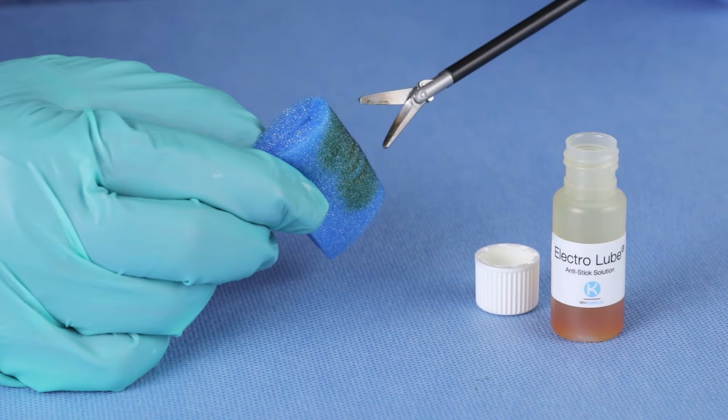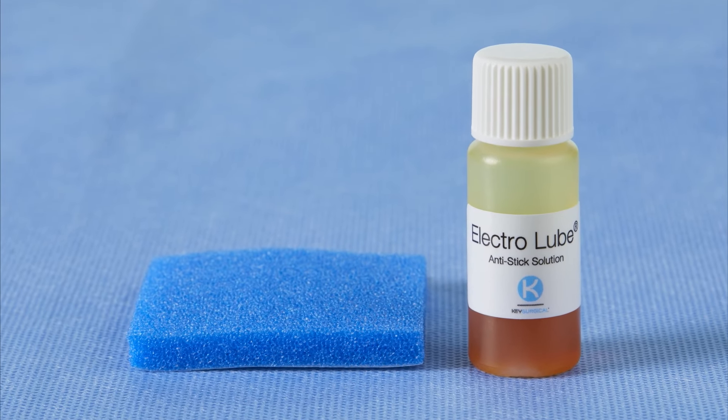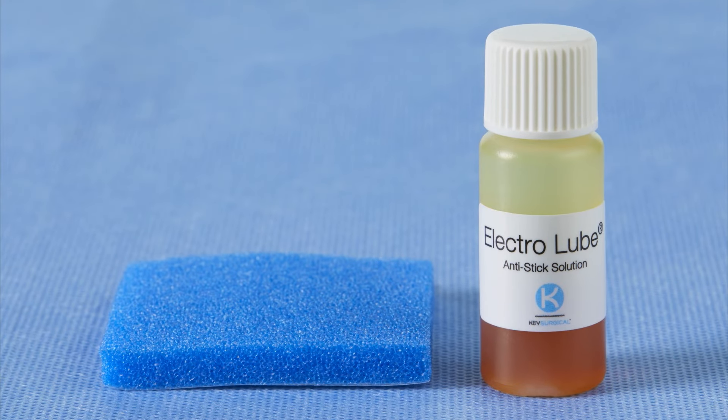Electrolube can be reapplied as needed. The included foam pad has a radiopaque strip and also features an adhesive backing. For counting and disposing, please follow your facility policy.